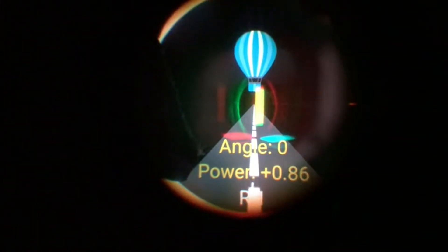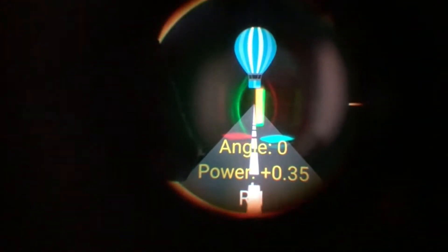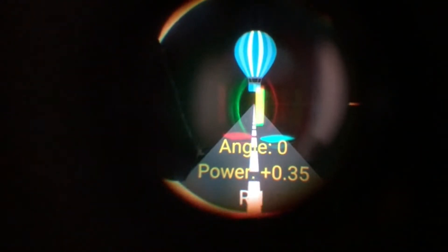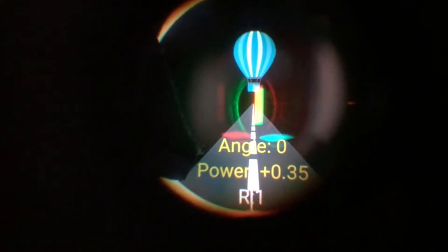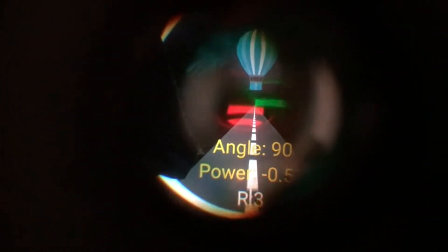The lines have started to overlap. And once the lines are fully overlapped, we can then move to a different angle, the next one. For the full test, the user will be instructed to go through eight angles per eye. Now I am turning the thumb wheel to the left to move the meridian. At this position, the lines are already relatively overlapped, and we are going to adjust it so it is fully overlapped. And when I am satisfied, press the middle button and onto the next meridian.